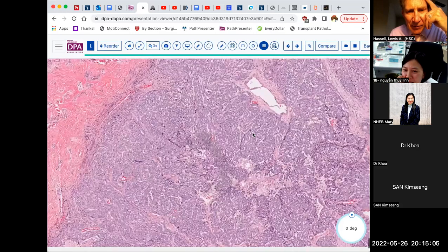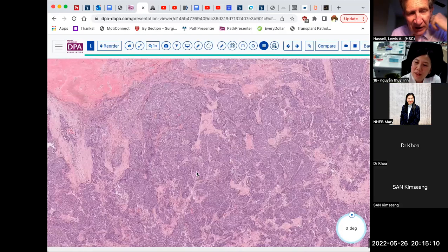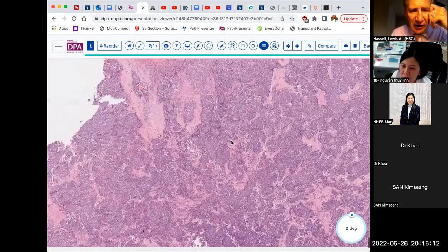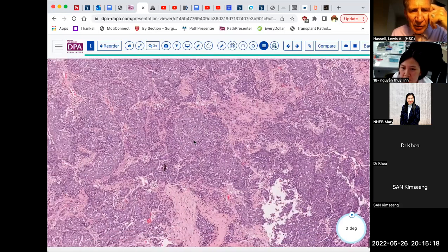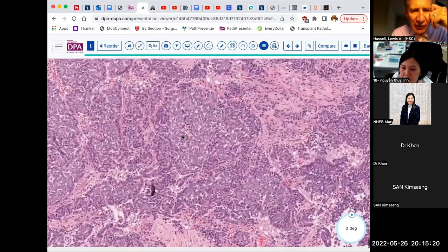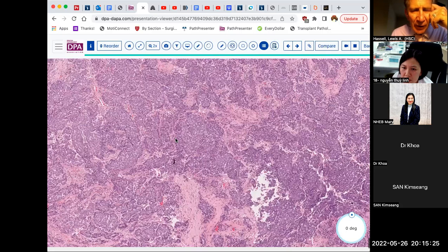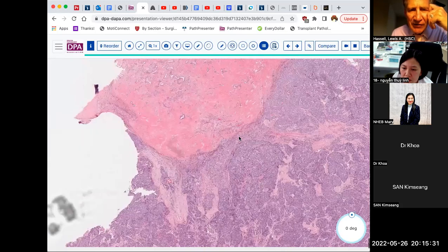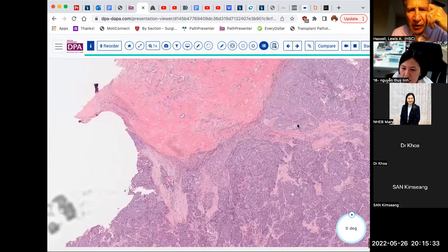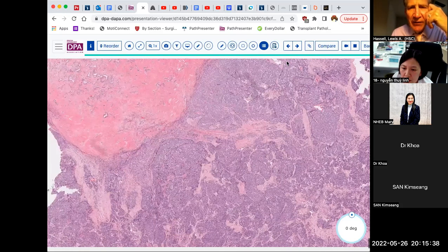And so this pattern you could call a combined hepatocellular cholangiocarcinoma, particularly if you had any sort of hepatoid markers being expressed in this area, like glypican-3 or arginase or Hep Par-1, or the absence of CK7, for example, or even just a different pattern of CK7 between this tumor and this tumor, I think would enable you to call this a combined hepatocellular and cholangiocarcinoma.